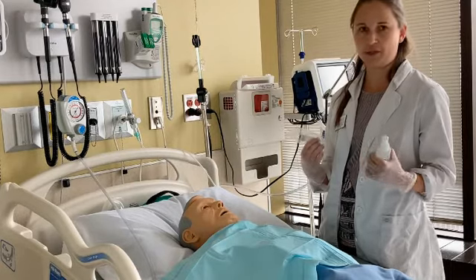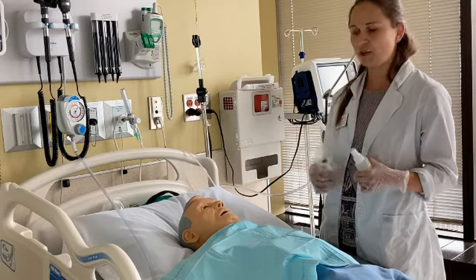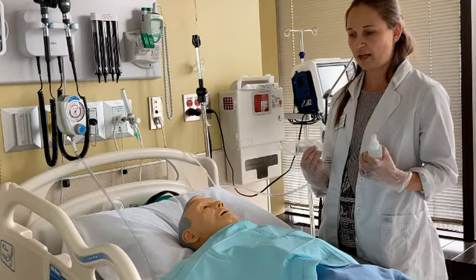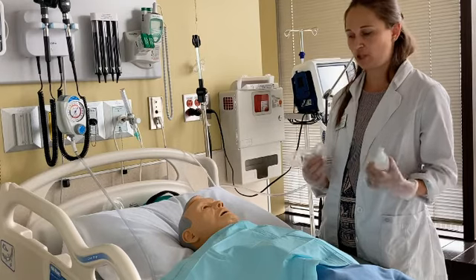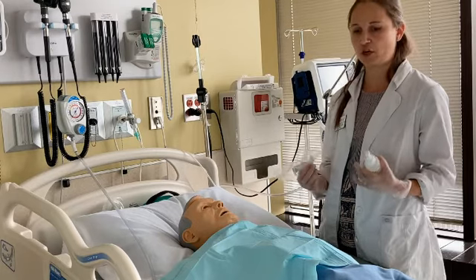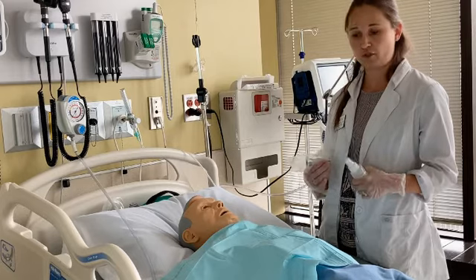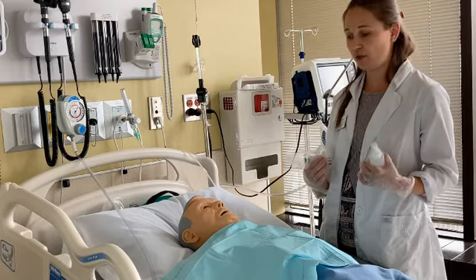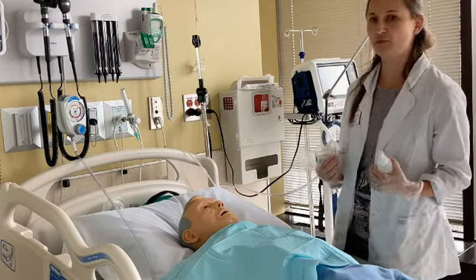So why would I choose an oropharyngeal airway over a nasopharyngeal airway? Each of them has their own uses and benefits. For example, a nasopharyngeal airway does not stimulate a patient's gag reflex, so I can insert it on a patient who is semi-conscious or even conscious. The reason to insert this airway may be to preserve the integrity of the airway, but it could also be used for frequent nasopharyngeal suctioning.